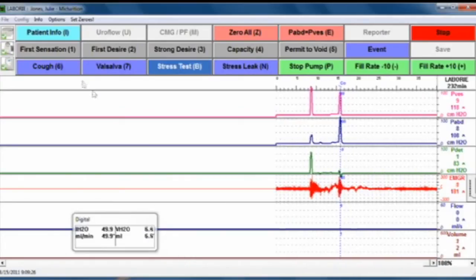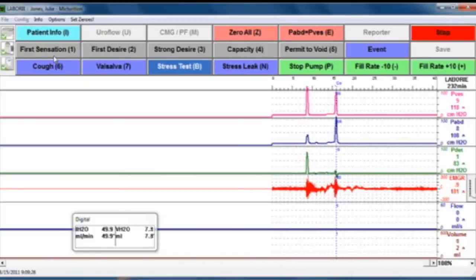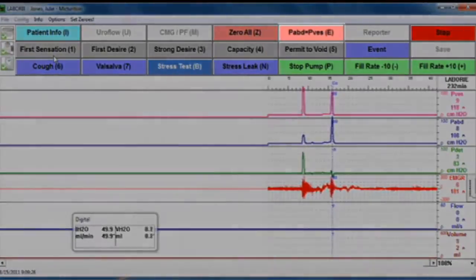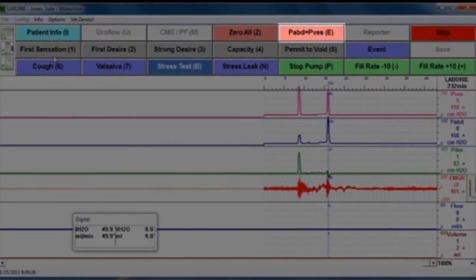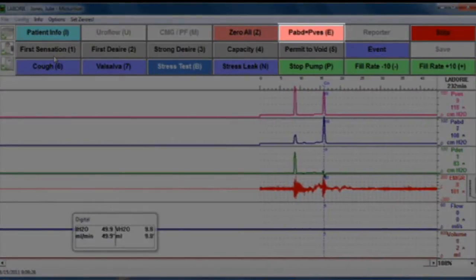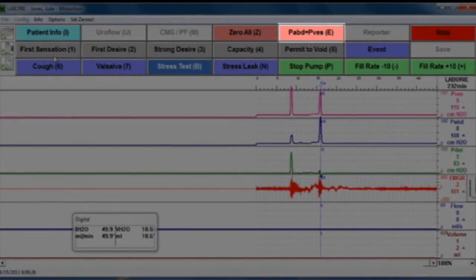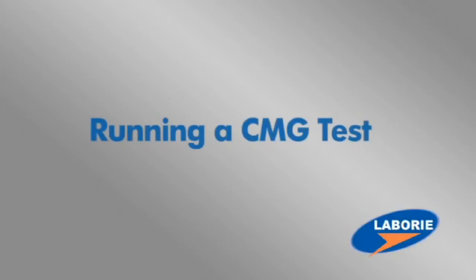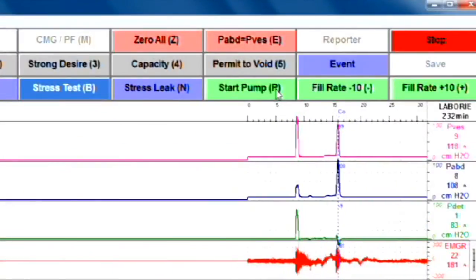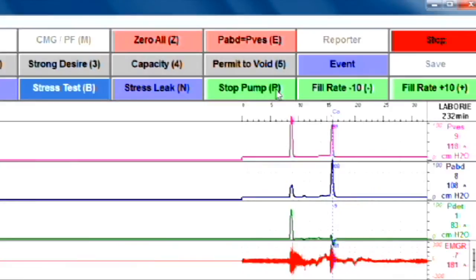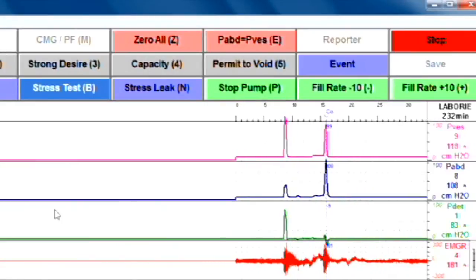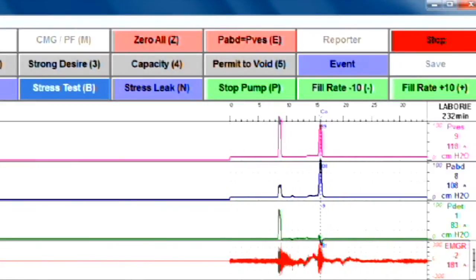If both pressures respond well but the PDET is slightly negative, you may choose to click the PABD equals PVES button. Now begin filling the bladder by clicking the start pump button.